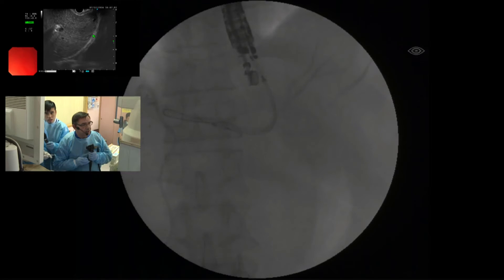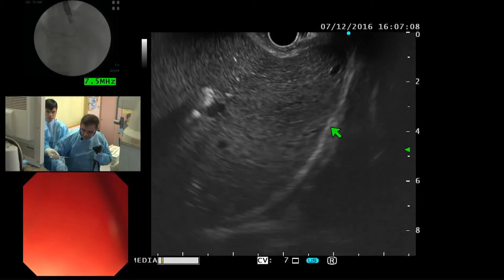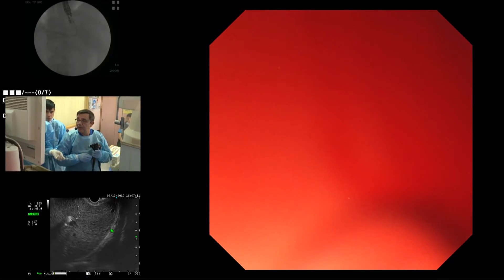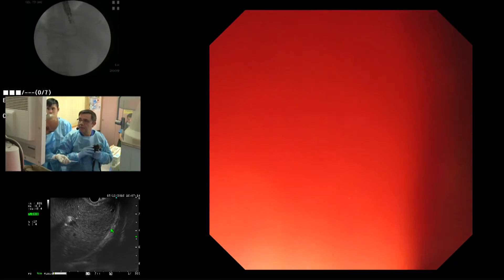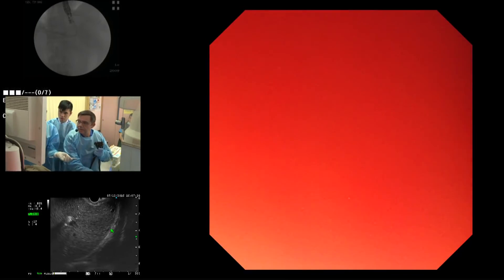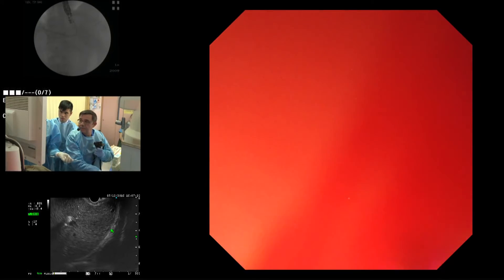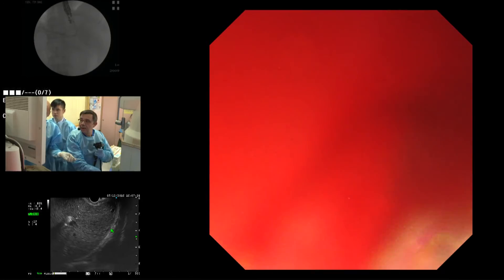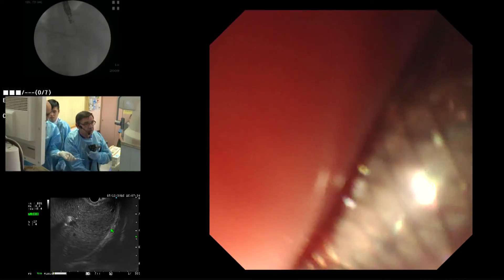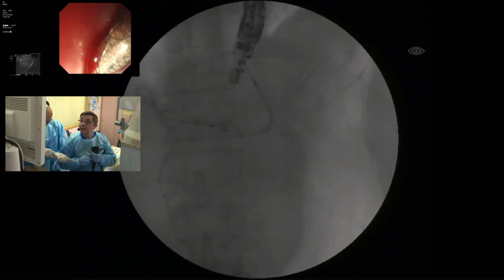This is the halfway mark. You can sort of see it hiding at around the 4 or 5 o'clock position. Yes, we can see it now. Okay, this is not so bad — and you can continue to deliver the stent completely.